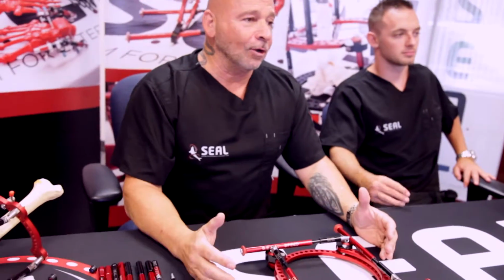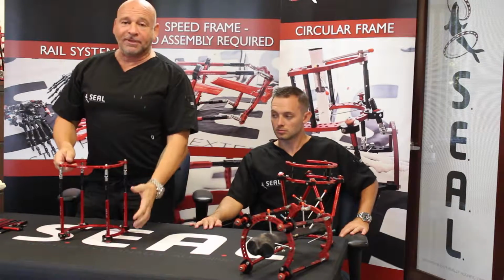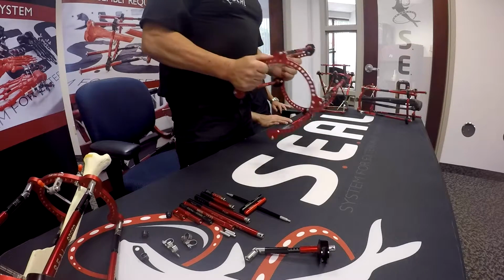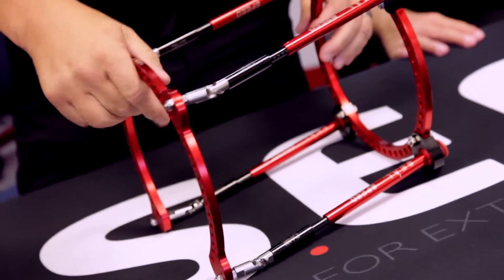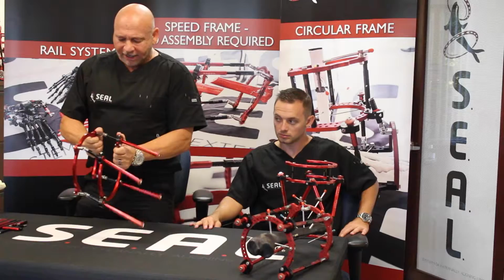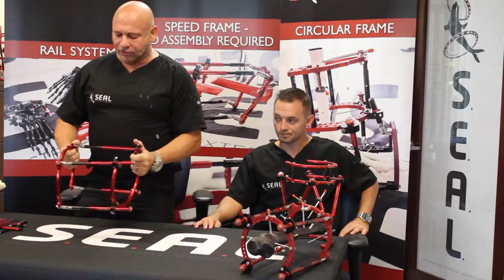If it's peel packed in the OR or in the ER, it merely needs to be pulled out of the peel pack. The surgeon or assistant could just open it up on the table like this. It'll drop down. It's ready to be put on. If you want to put it on like this, it still has the ability to rotate, angulate, and do everything. You can pin the first fragment with this ring on, then pin the second fragment, and then you have the ability to angulate, rotate, compress, distract, and rotate the fragment anywhere to reduce it.